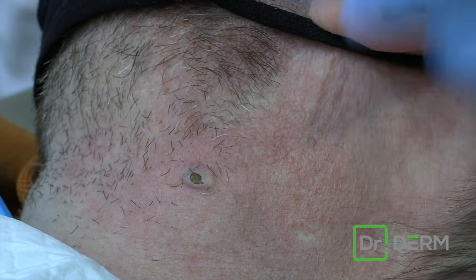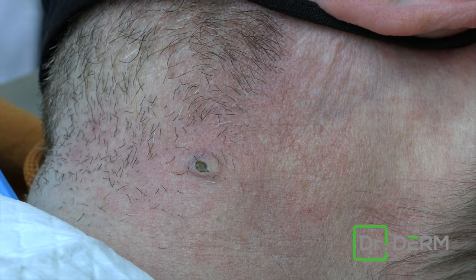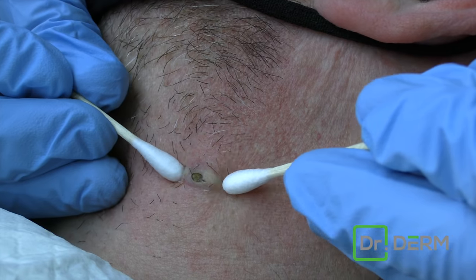So just basically open this just a tiny bit with this little lancet, and I think this will come out pretty dang easy. Use a couple of Q-tips.